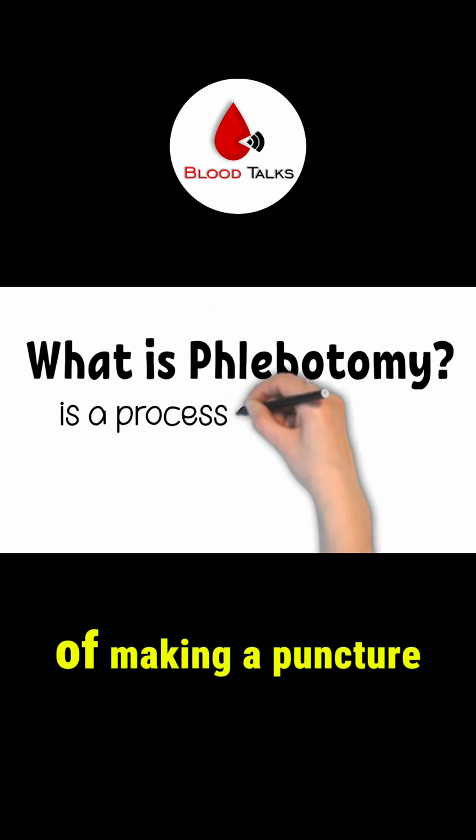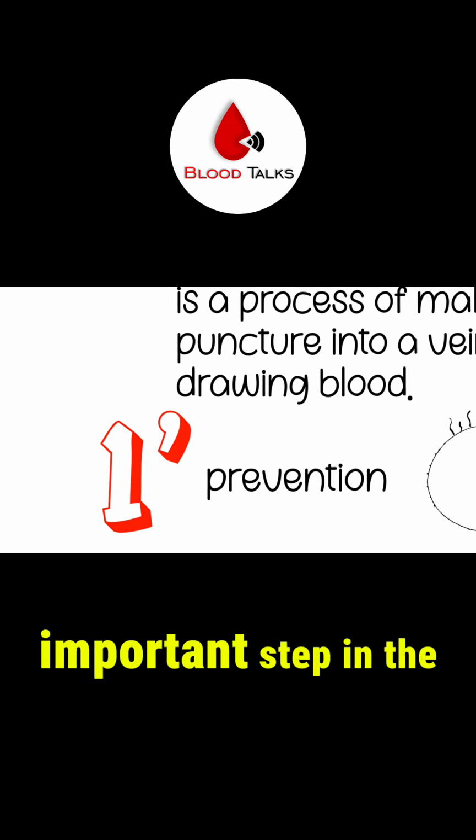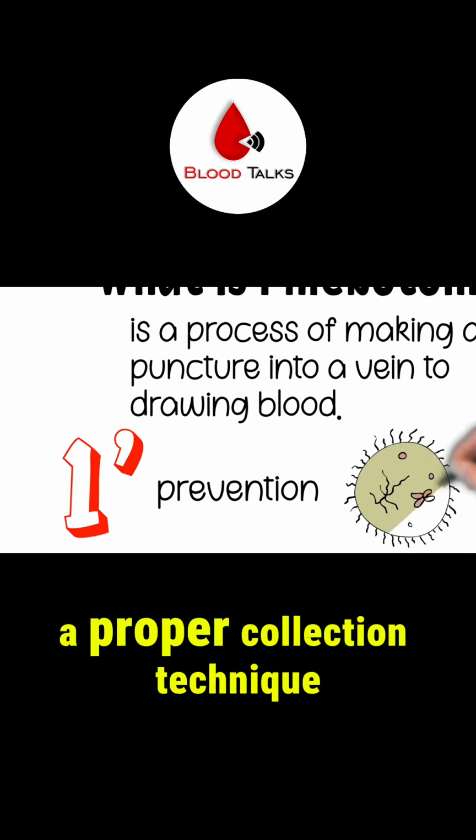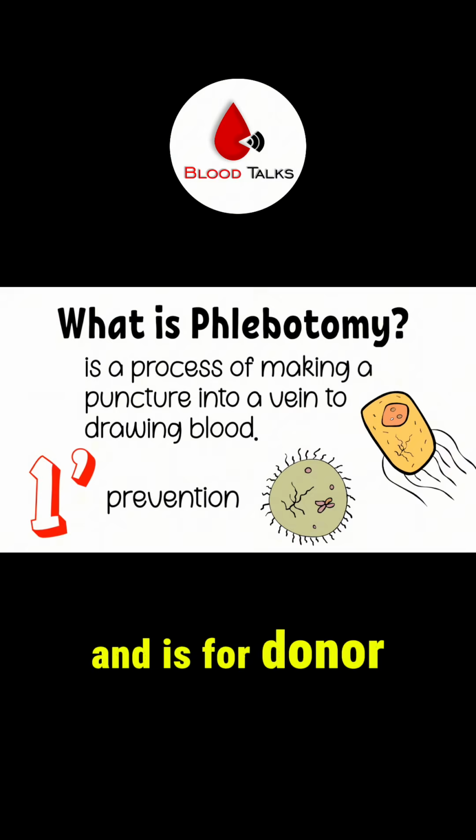Phlebotomy is the process of making a puncture into a vein to draw blood. This is another very important step in the blood collection process. A proper collection technique is essential to minimize contamination and for donor safety.